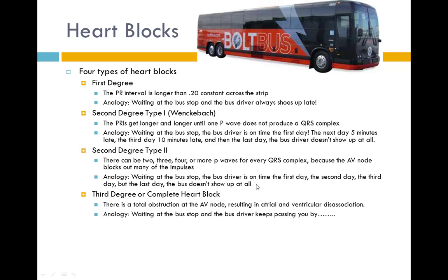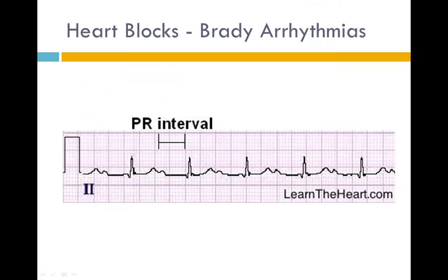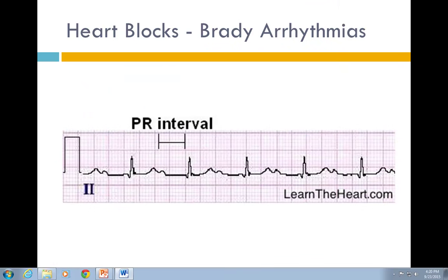So the top of the heart and the bottom of the heart is not communicating. So the analogy for this, back to the bus system, you're waiting at the bus stop and the bus driver just keeps passing you by every single day. That would be complete heart block. So let's look at these actually in their rhythms, okay?